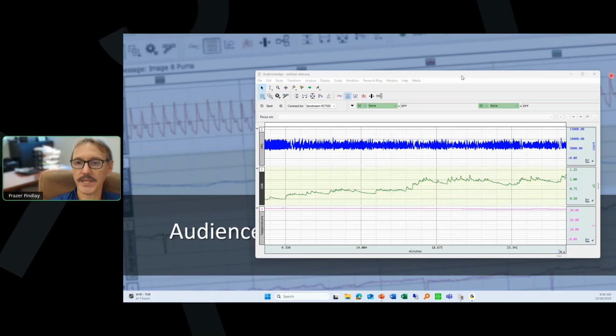Then apply all your biopotential electrodes, whether that be EDA, facial EMG, or ECG, and by the time you've completed everything and you're ready to start recording data, the 5 minutes has naturally passed. You don't actually have to hold the participant back and delay the start. So anyway, that sort of addresses one of the questions that I realized I skimped on.